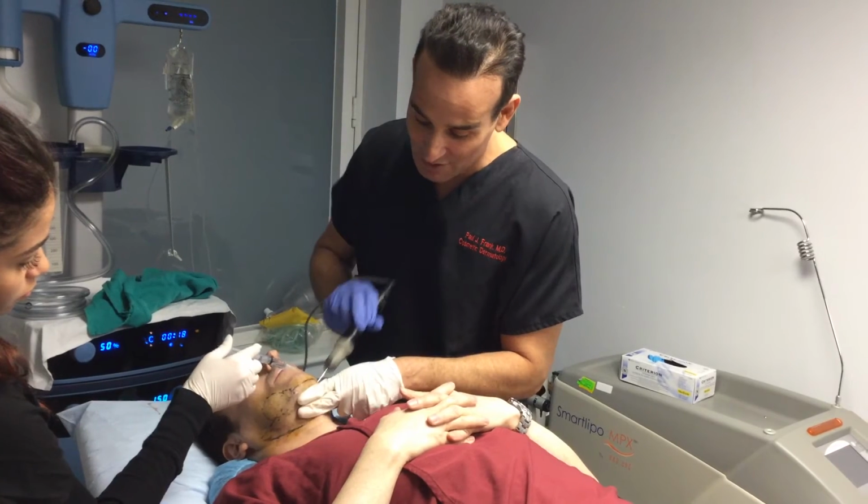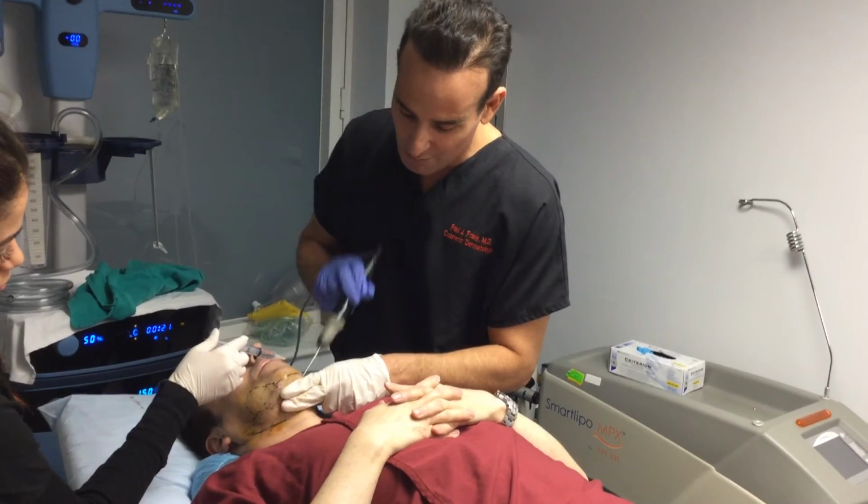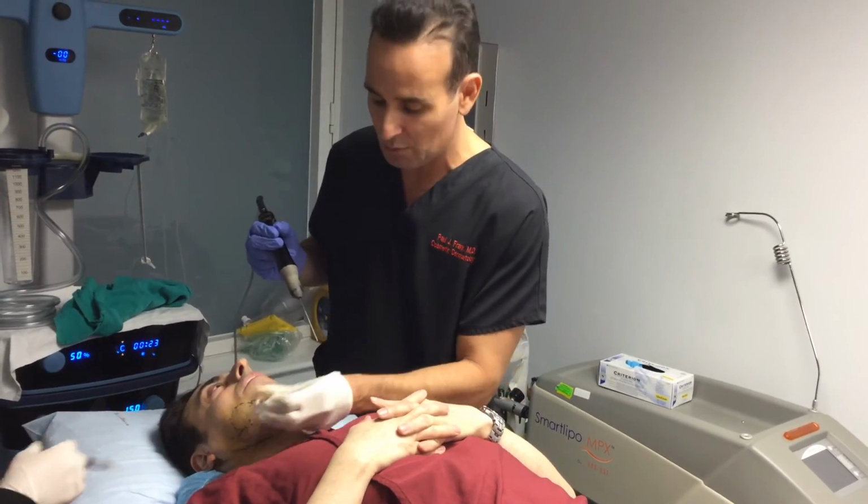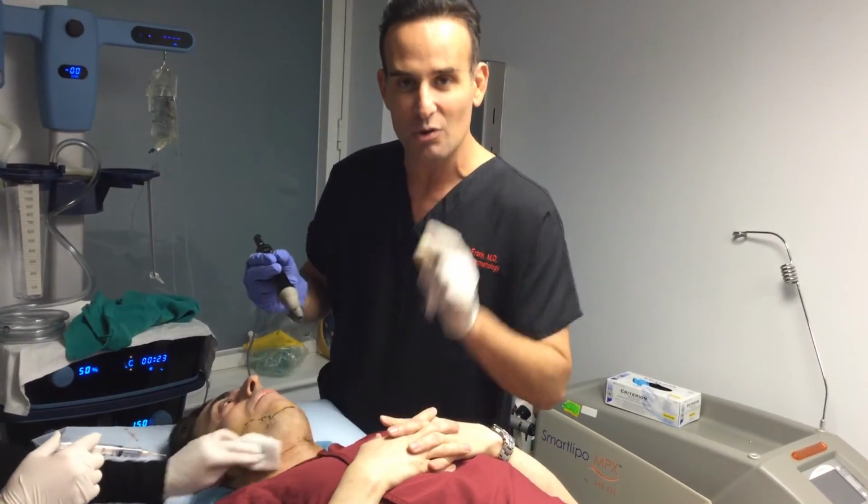He's not in any pain whatsoever. And then we'll bandage him up and go over post-op. So this is really the procedure. All done through these two little holes that will close up without even a stitch. So we'll see you in post-op.